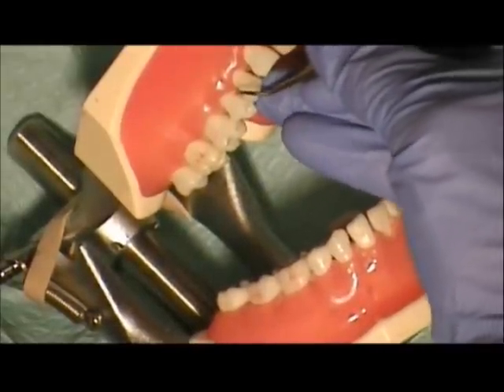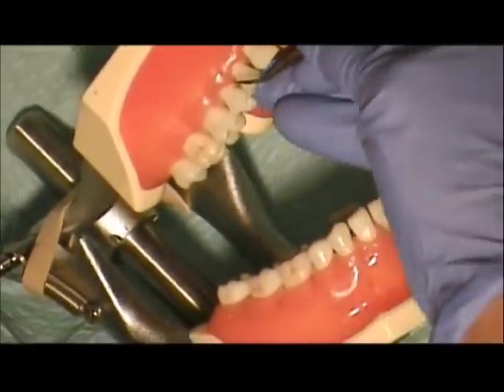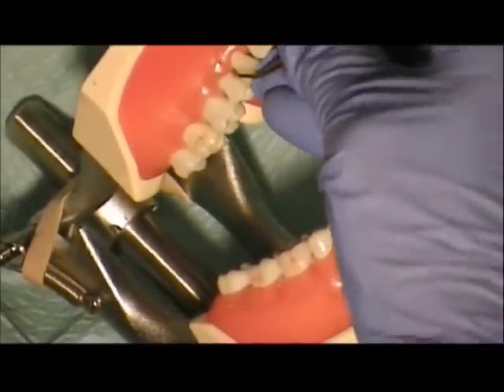Over to the distal of number 5. There's our 90, there's our 70, and small little strokes right under the contact.